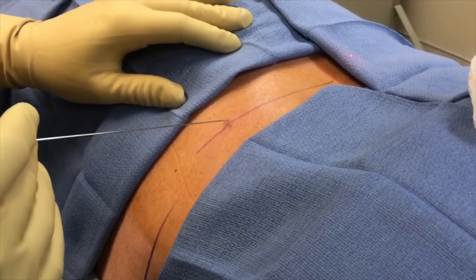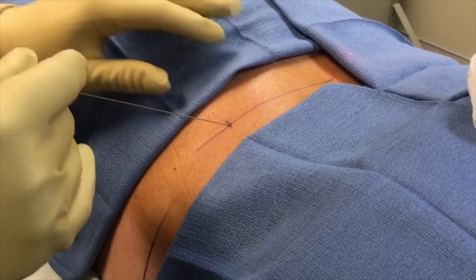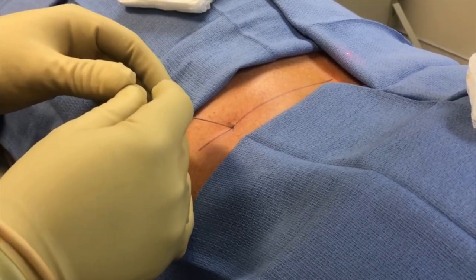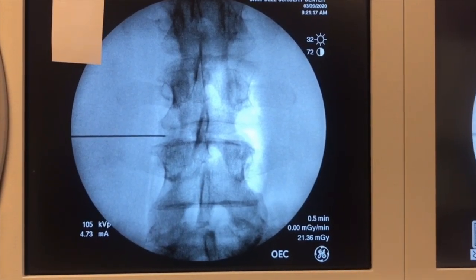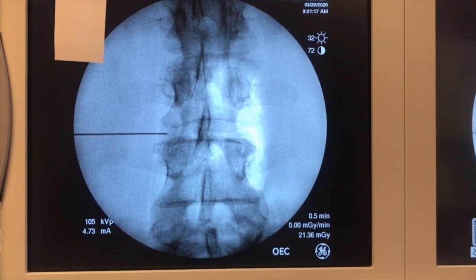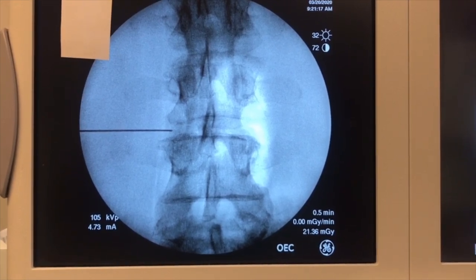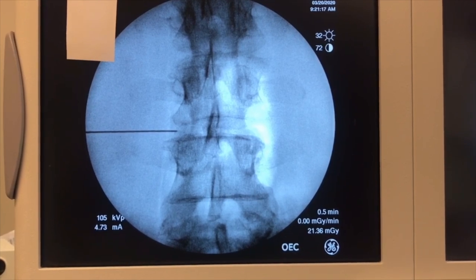We then skive off the ventral part of the facet into the foramen and Kambin's triangle. I tell the patient, 'You're going to feel a little pressure on your side — tell me if you feel pain going down your leg.' I brace against the side of the body, use two hands, and advance the needle. Following the two lines, keeping the needle parallel to both, we're right on target for the facet. I can feel a little resistance — I know I'm in the facet capsule.